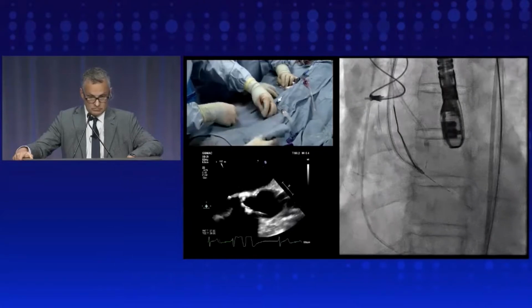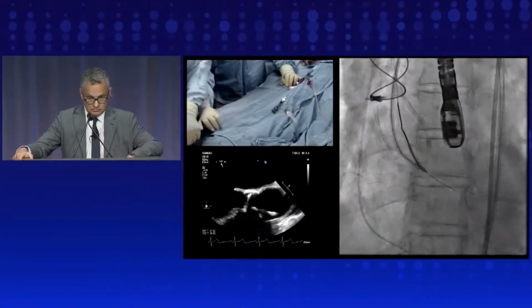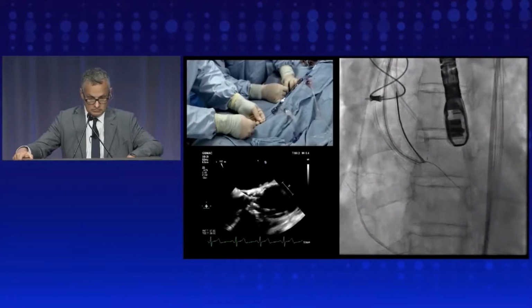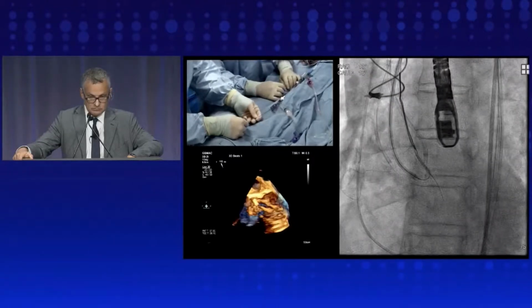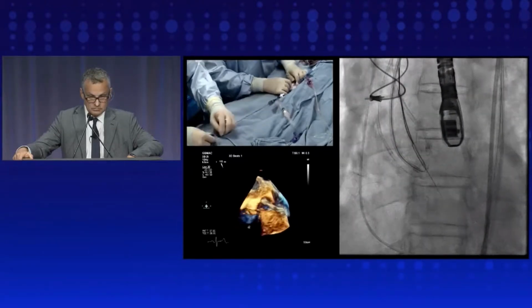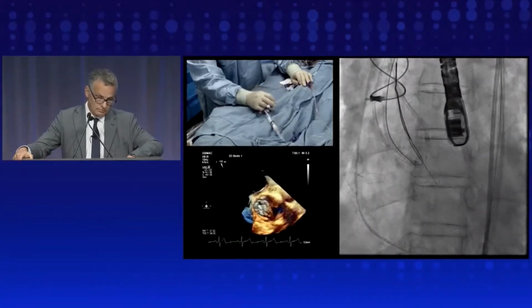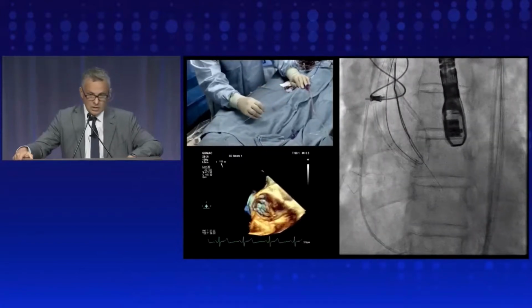He captured it, and now the plan is to basically use that snare to bring the tip of the wire retrograde back into the receiving snare catheter, and then ultimately we'll set our kink on the wire and then be able to snare it. Yeah, let's move slow.